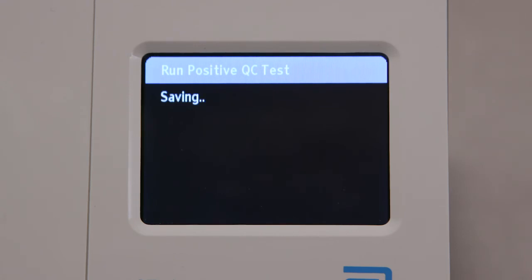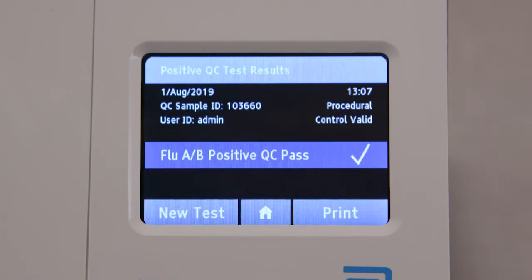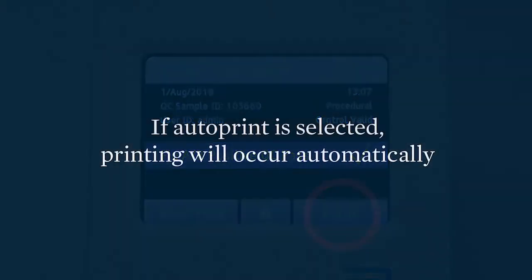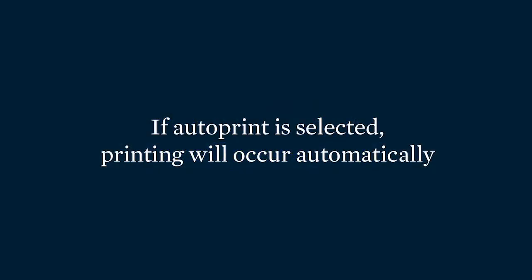The IDNOW instrument reports QC results as pass or fail. If you are using the optional printer, press Print to get the results. If auto-print is selected, printing will occur automatically.